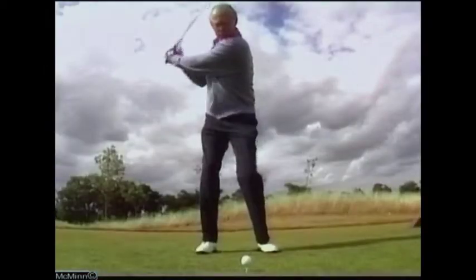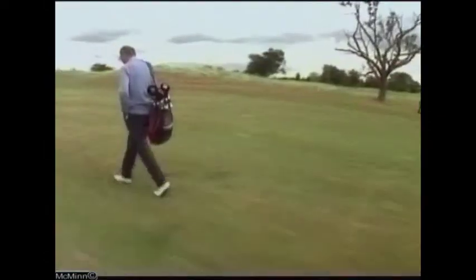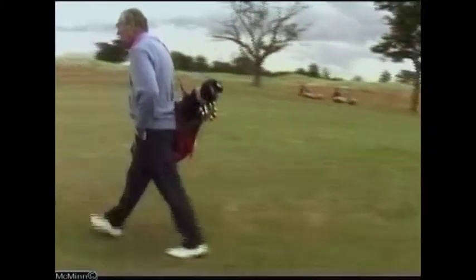Vigorous exercise is not advised for people with a conventional hip replacement, as it can lead to premature wear and loosening of the joint. David McMinn believes the reverse is true for his implant, as exercise may prolong its life by improving bone density in the femur, bone that hasn't been removed.